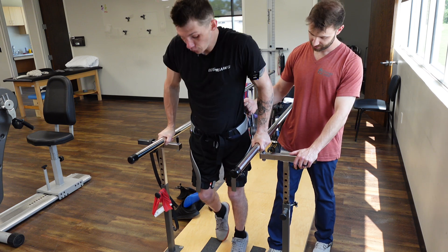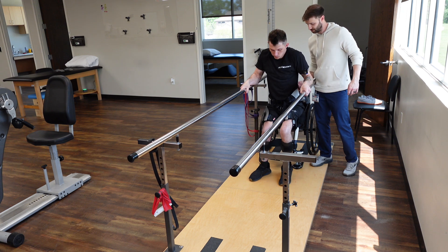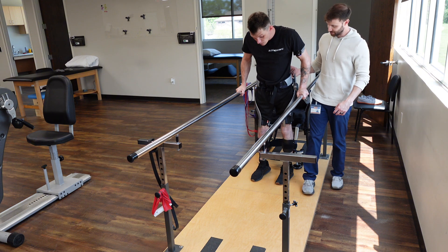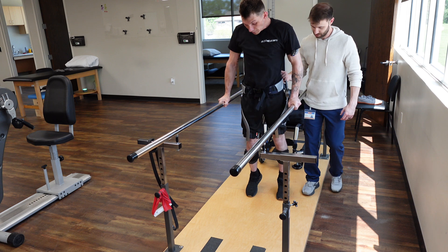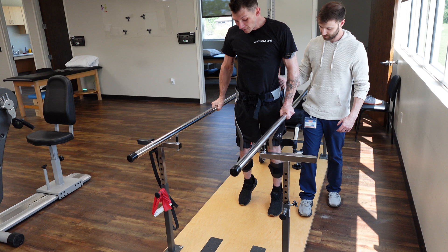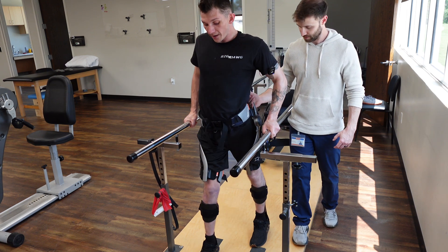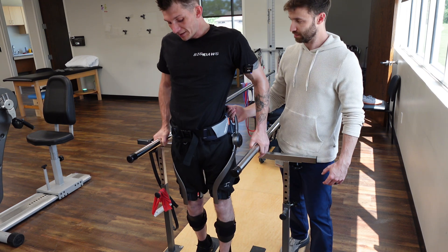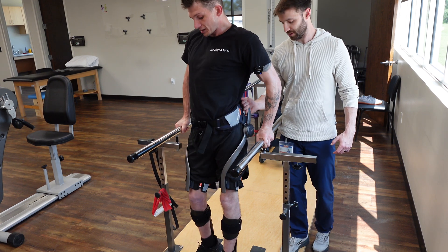I just got to lean you forward a little bit more. I prefer you to be more upright, but just for the sake of seeing what turns it on. Oh, something turned on. That was that fake hip flexion, right? This might not look like much, but it's extremely hard for me to get my left leg to do any decent step-throughs, and the fact that I'm able to pass my right foot up with my left foot is saying it's helping.